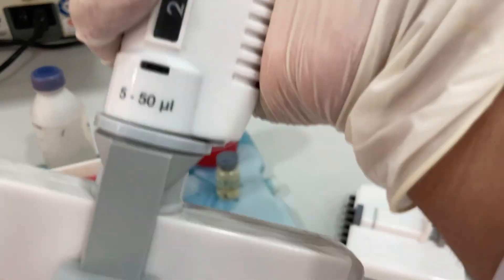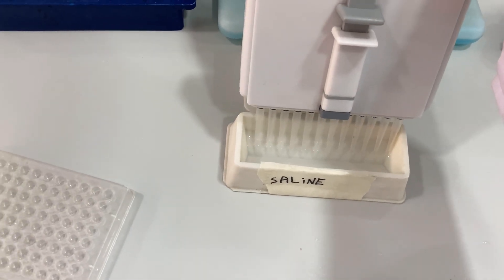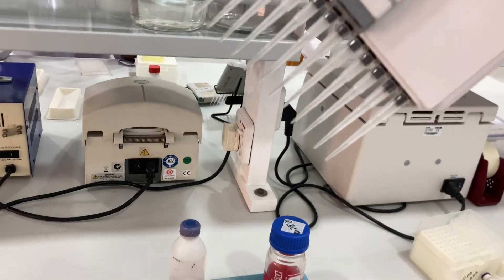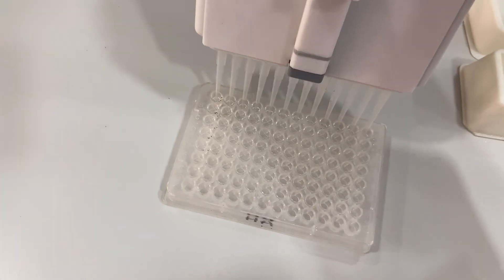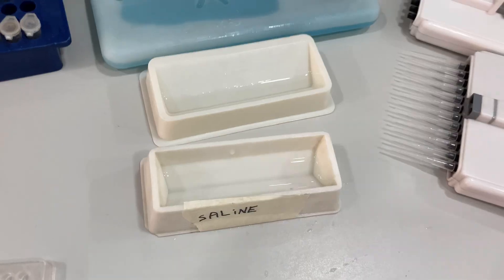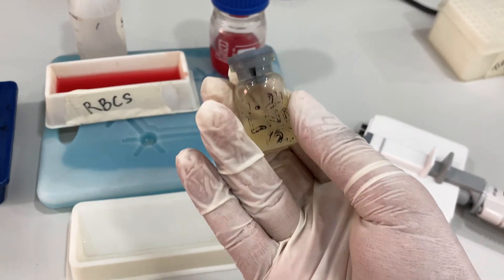In the serology section, we are going to perform hemagglutination assay (HA) and hemagglutination inhibition (HI). Firstly, we will perform the HA. For that, we have to take 25µl of normal saline up to 11 wells. This is our ND virus for which we have to perform the assay.